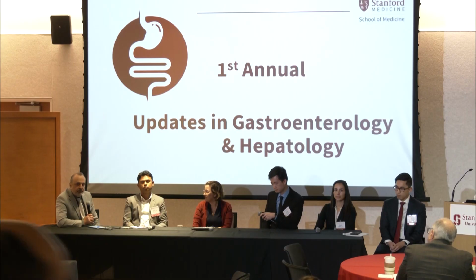I think the other side point to mention is that most rigidizing overtubes that are available right now by Neptune are accommodating the PCF enteroscope or the EGD scope. There is a variant accommodating the CF scope, but most practitioners use the variant that's a little bit smaller diameter. Either way, you're increasing the diameter of whatever is going in through the anus. And so for patients who have more tortuous or angulated anatomy, I'm not sure if I would start with the overtube. Great, thank you.